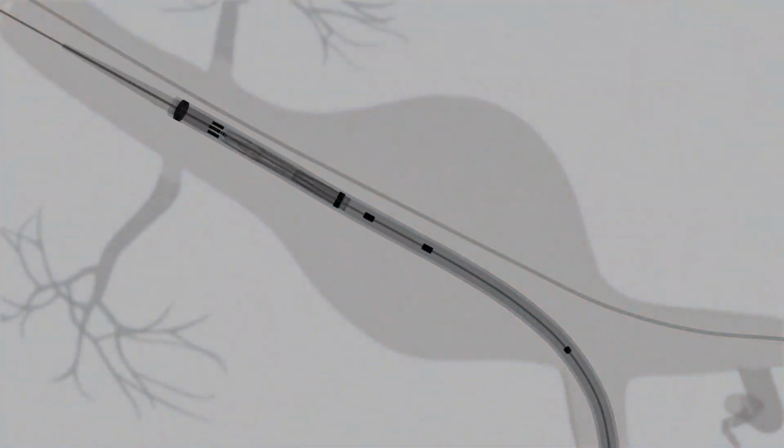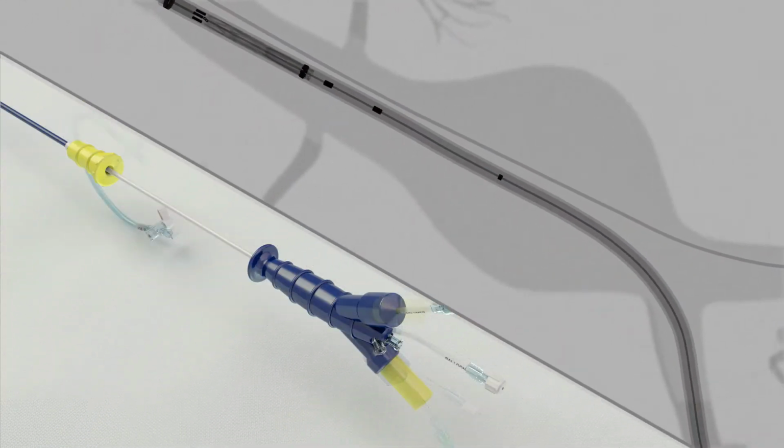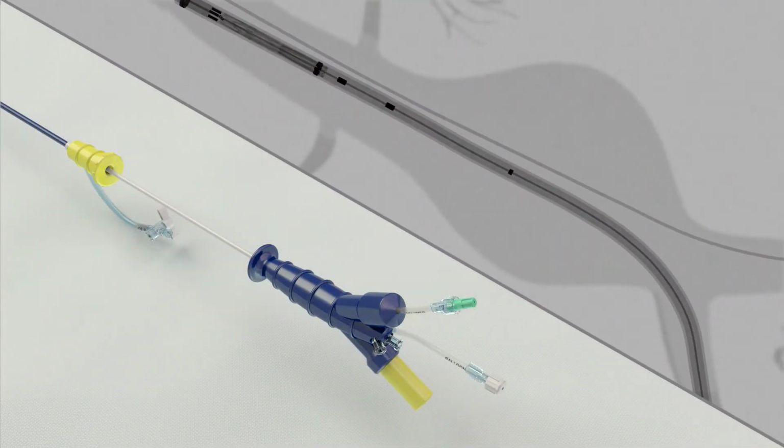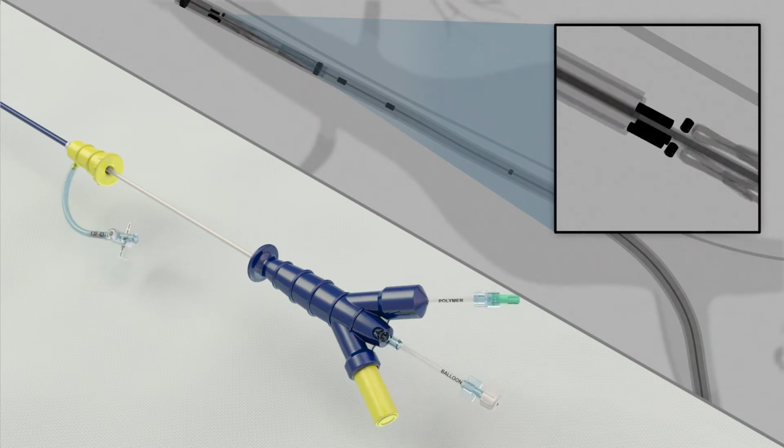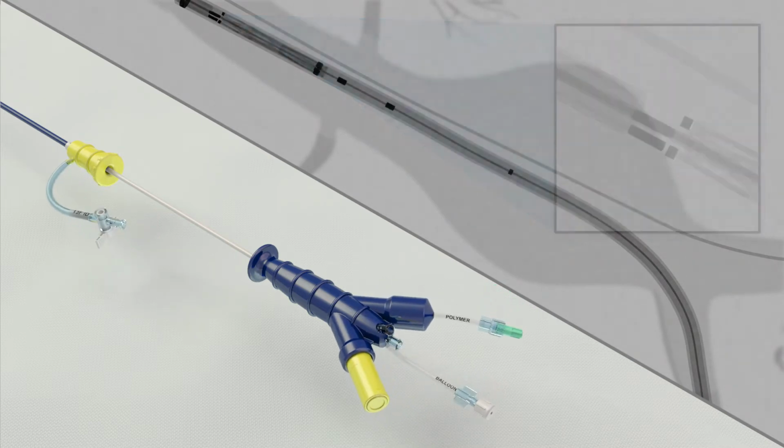Using fluoroscopic guidance, advance the delivery system until the radiopaque markers are about 1 centimeter proximal to the intended landing site. Orient the aortic body medial-laterally to align delivery system markers on either side of the guide wire. Place the long delivery system marker towards the patient's ipsilateral side.